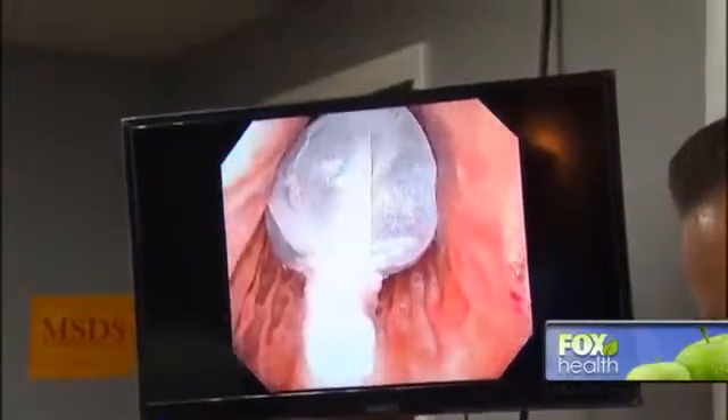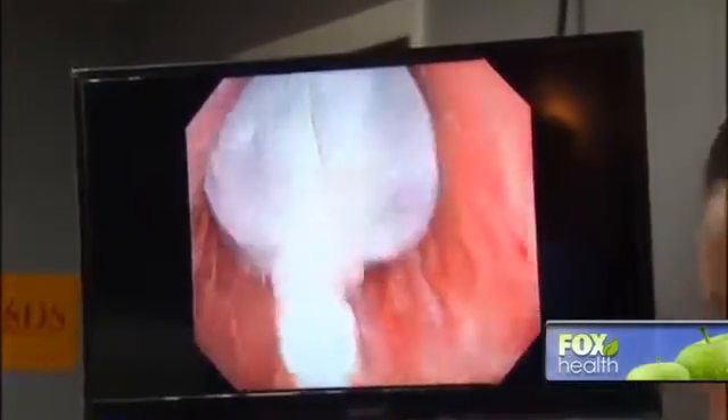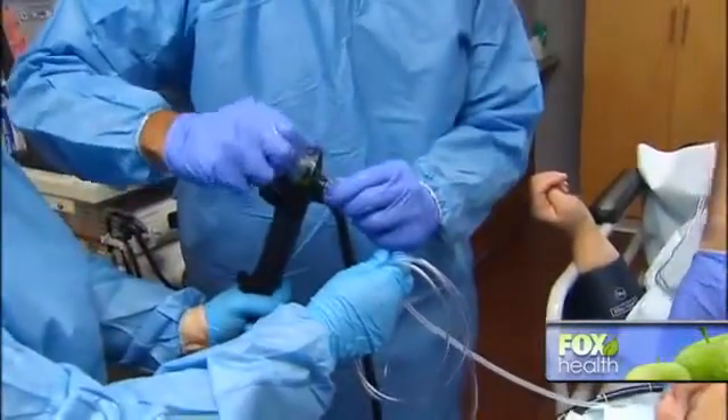What you're looking at is the Orbera gastric balloon being inflated inside a patient's stomach. The objective is to lose weight. Dr. Prem Shatou is a New York-based gastroenterologist who performs the procedure.